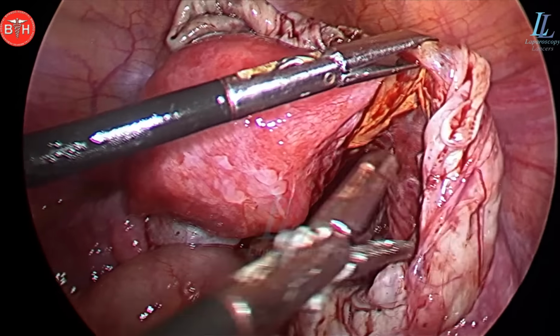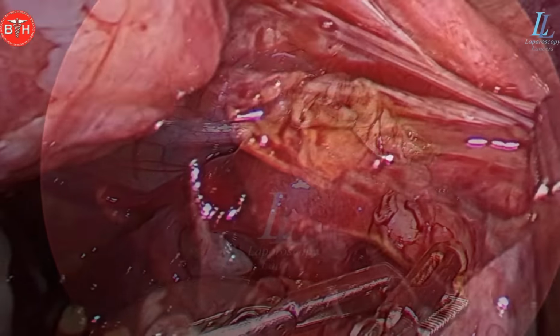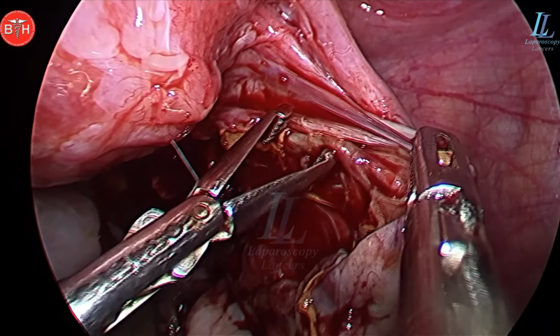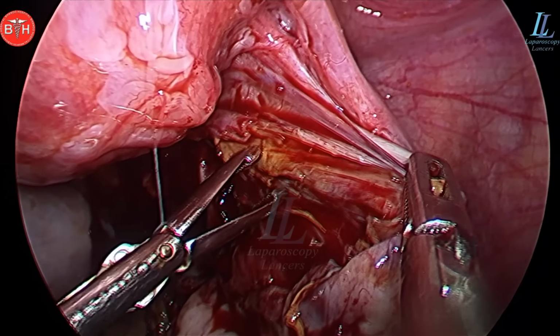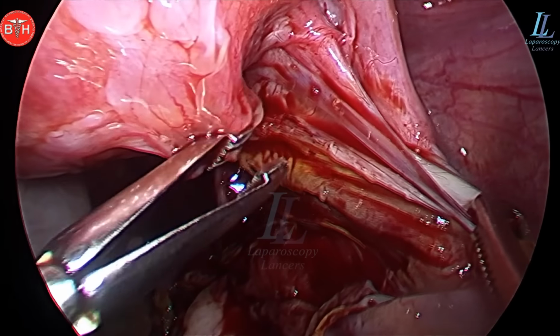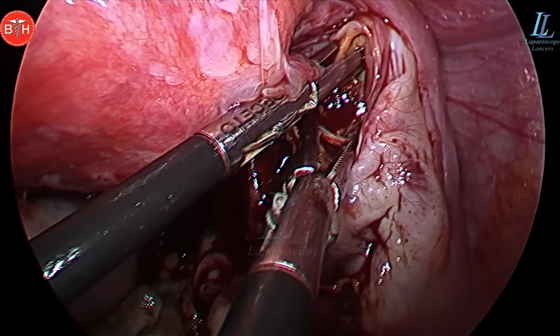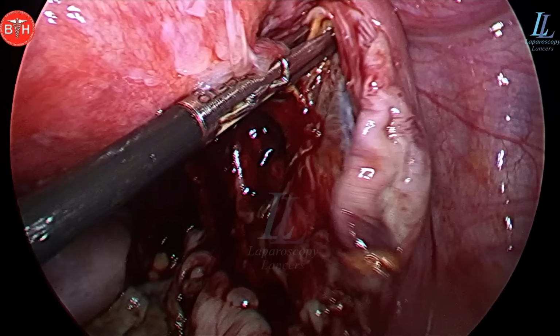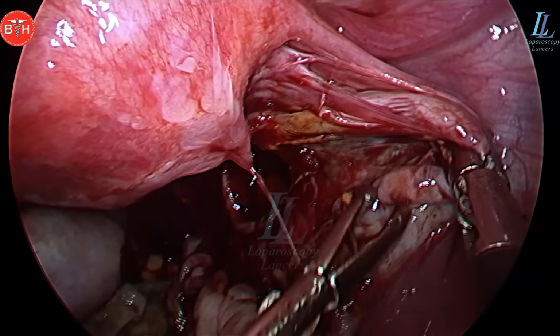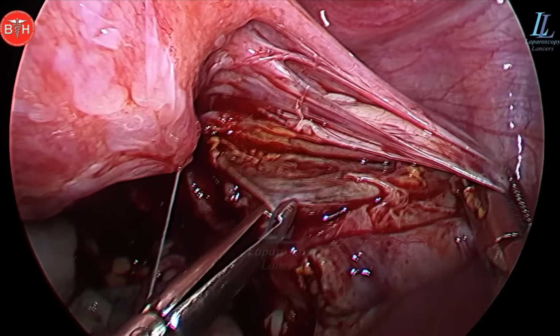But still the search continues, and there you can see the blood stained structures that's causing a doubt. It is slipping. I should not hold it that tight also, and the structure excision should be very precise, as what you call surgical precision should be there. There you can see the bluish structure, and that's a cyst that I have found now, and this also has to go, else I'll be doing an incomplete surgery.